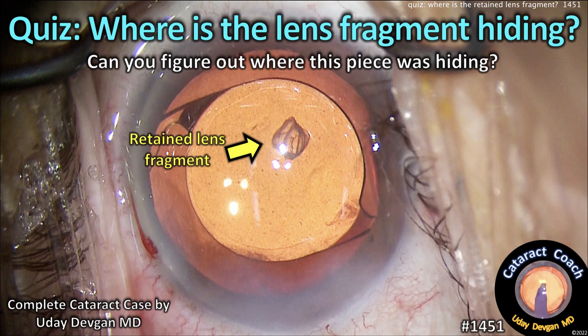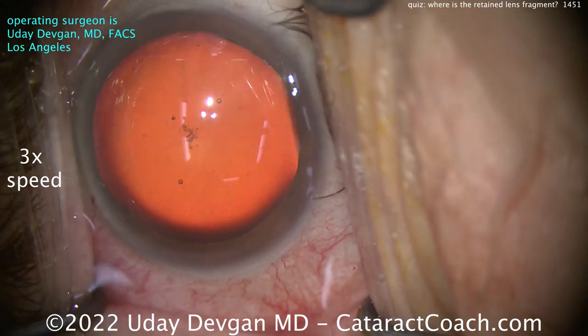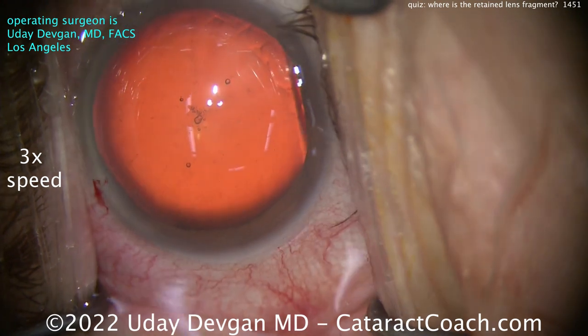Cataractcoach.com cataract quiz: where is the lens fragment hiding? Can you figure out where this piece is hiding? Watch carefully. Let's get through the beginning of the case sped up so you can see it's a normal case.